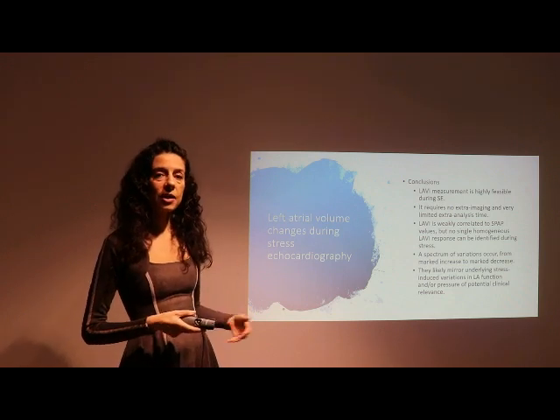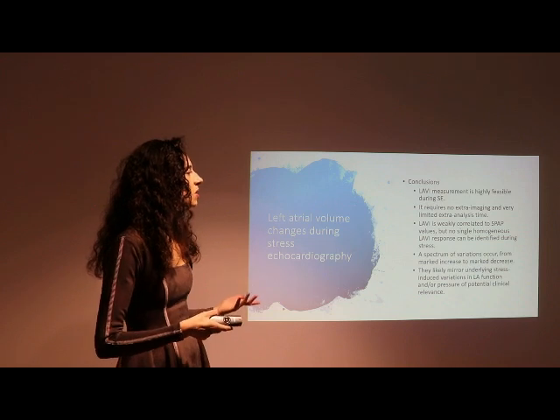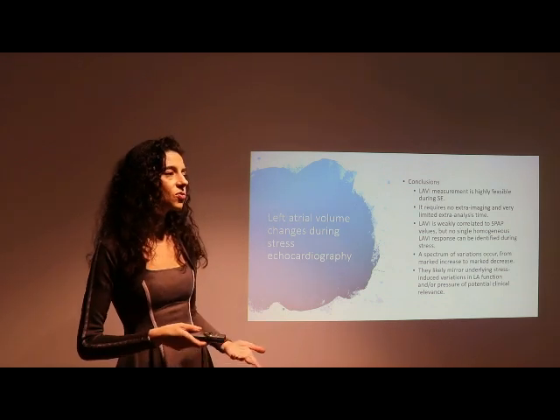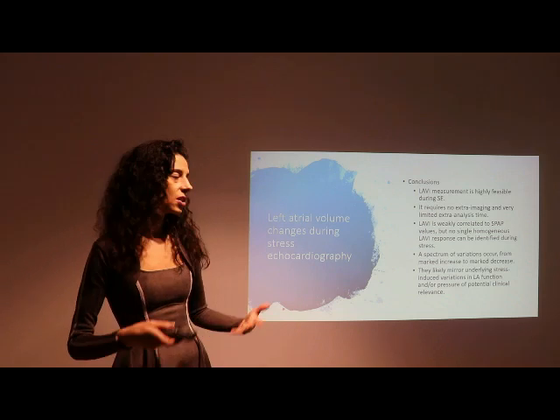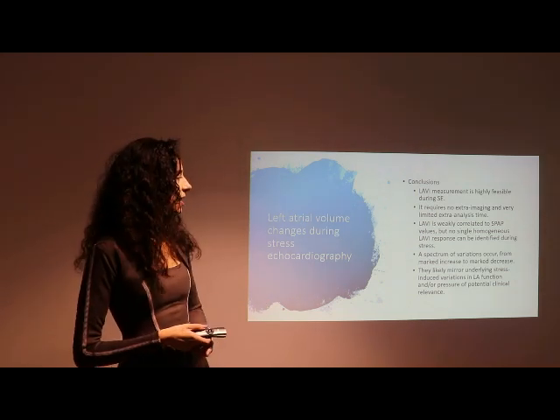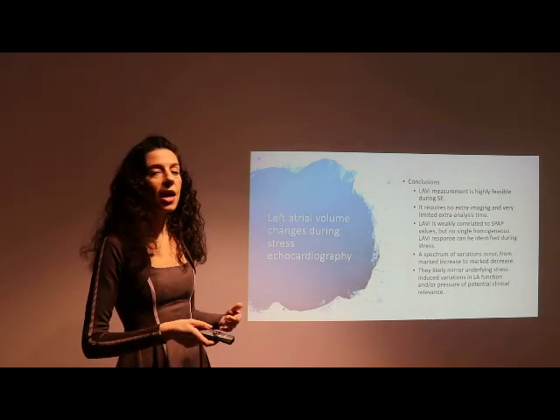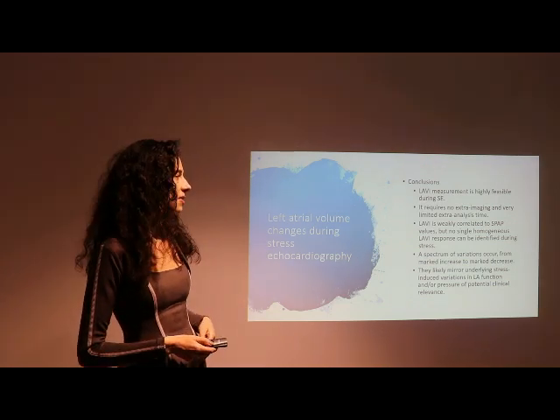LAVI is correlated to SPAP, but no single and homogeneous LAVI response can be identified during stress. A spectrum of variations occur from a marked increase to a marked decrease, and these likely mirror the underlying stress-induced variations in LA function and or pressure of potential clinical relevance.